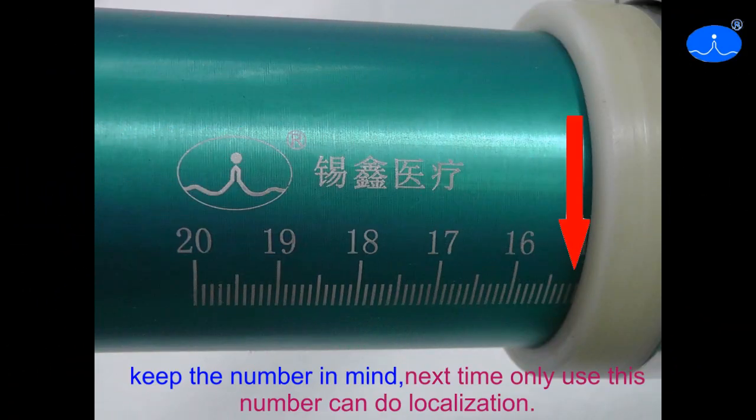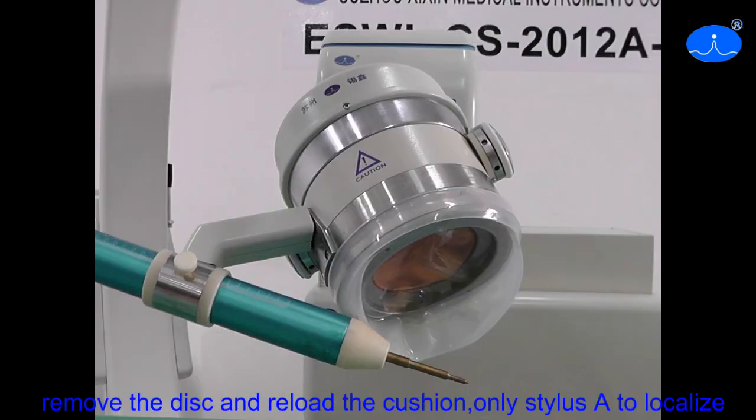Keep the number in mind. Next time, use this number and do localization. Remove the disc and reload the cushion, only stylus A to localize.